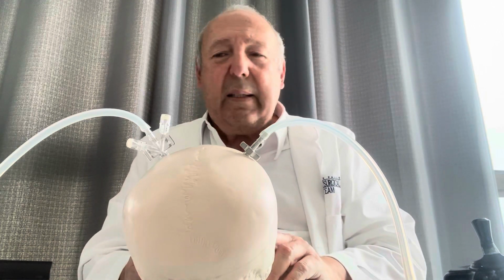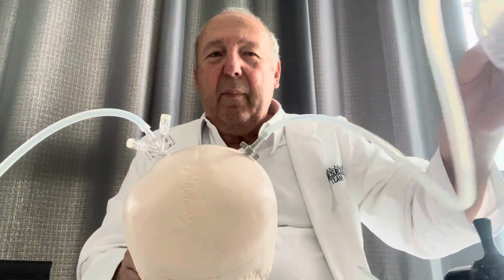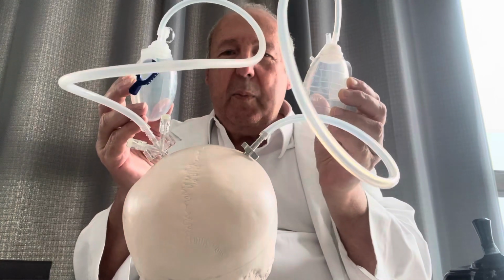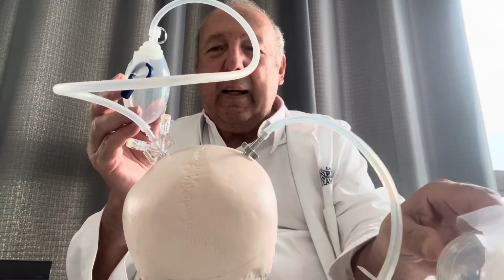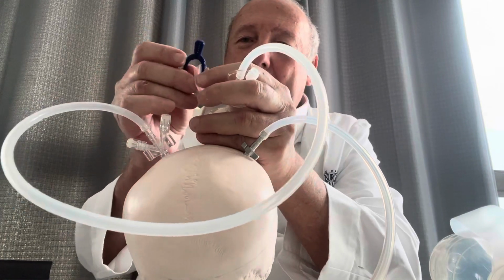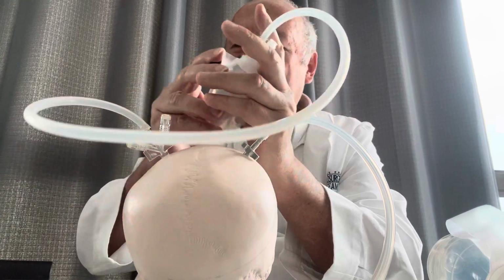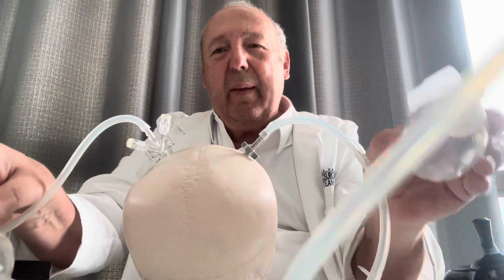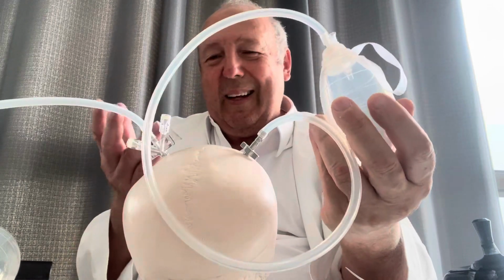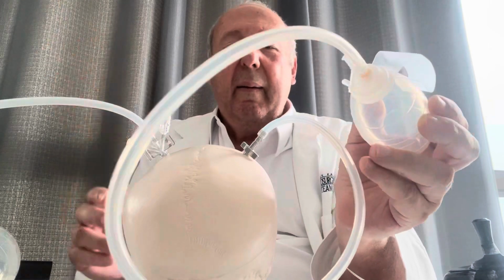And last, just a minor detail. As you know, the systems are connected to suction bulbs. The NASP bulb comes with a clip to clip to the patient's gown, while the SEPS does not have such a clip, but that's not an issue. You can get a safety pin.